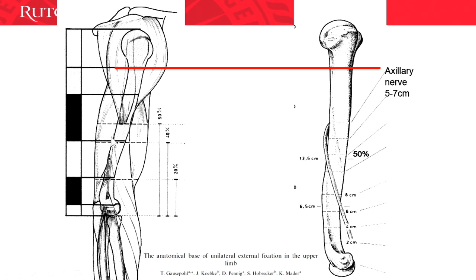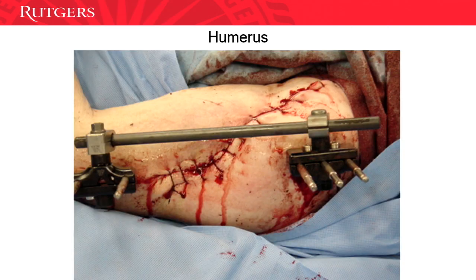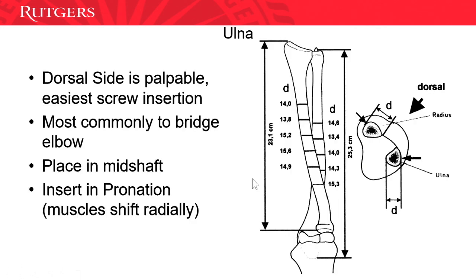If I'm anywhere close to this area where I think the nerve I'll be crossing, I always try to identify the nerve. I know that's another thing, we like to see where the nerve is, whereas my colleagues in trauma, they're like, nope, I think the nerve is gonna be there, I don't wanna be anywhere close to that, just move that away. But I like to identify where the nerve is. And this is what I meant, you can put this clamp right down where you think it's going to go. Your incision should be marked from one end to the other and make the whole incision to get down to place your pins.